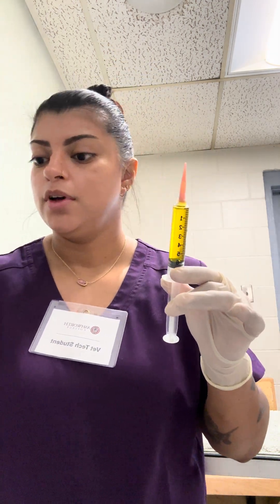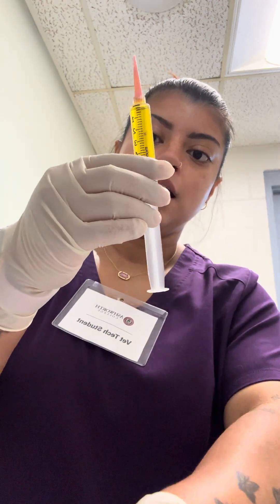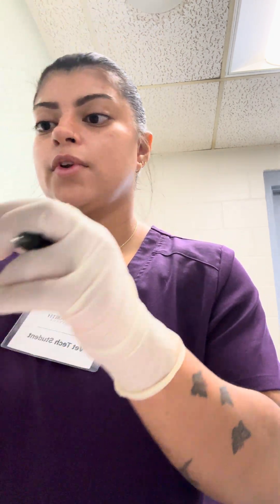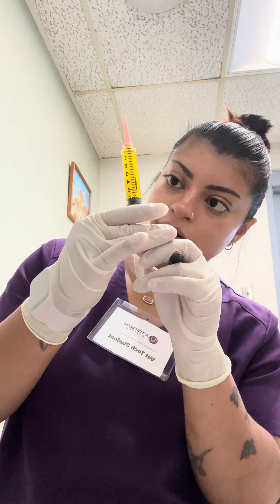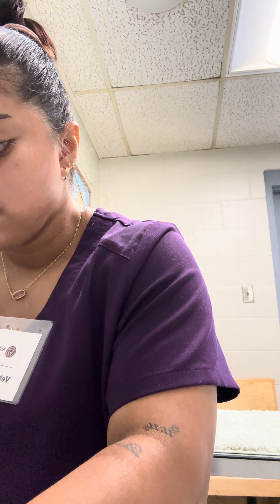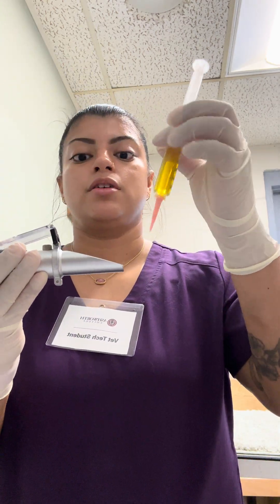Right here I have my urine sample. From this sample I can see that it's amber color. I'm going to go ahead and write that on my notes. What color is amber? Looking at it from this direction it's pretty clear, so I would say clear. This was collected from a free catch. So I've looked at the color, the source, and also if it's clear or cloudy.